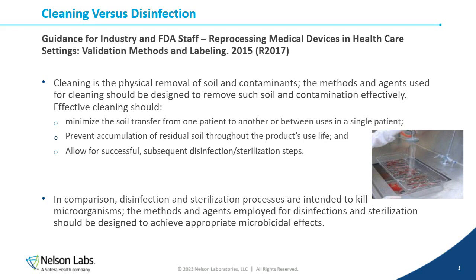So for cleaning, cleaning is the physical removal of soil and contaminants. The methods and agents used for cleaning should be designed to remove soil and contamination effectively. Effective cleaning should minimize the soil transfer from one patient to another or between uses in a single patient. It should prevent accumulation of residual soil throughout the product's use life and allow for successful subsequent disinfection and sterilization steps. So that is what the intent for cleaning is. The intent, as it says here, is just to remove soil and contaminants.